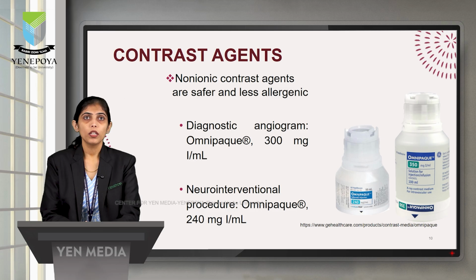Coming to the contrast media, we use non-ionic contrast media which are safer and less allergic to the patient. For diagnostic angiogram we use Omnipaque 300 mg, and for neurointerventional procedure we use Omnipaque 240 mg.